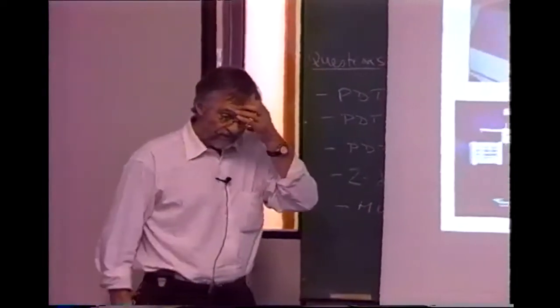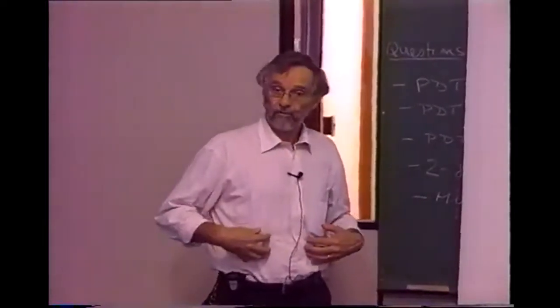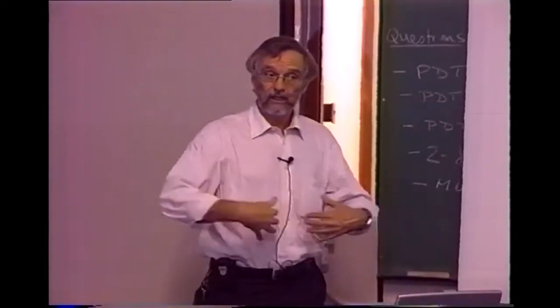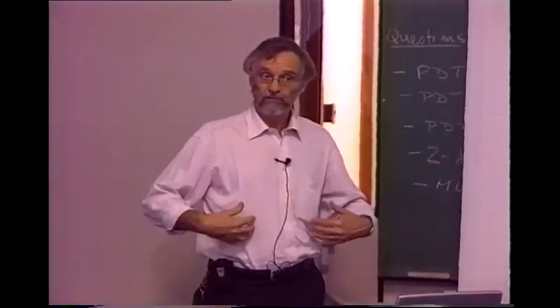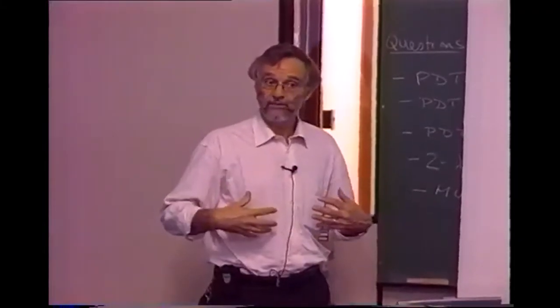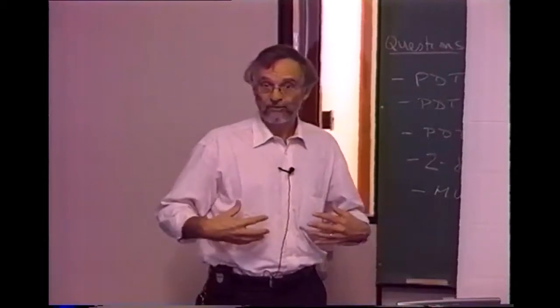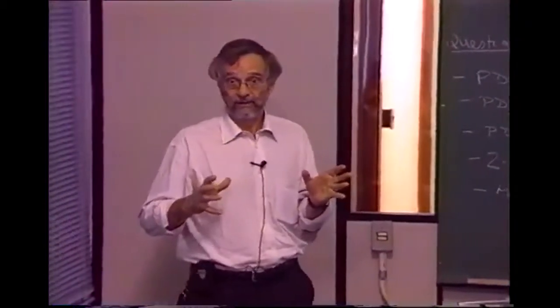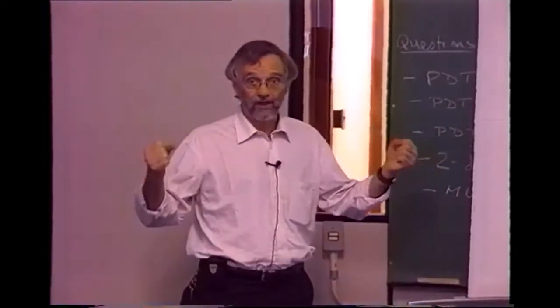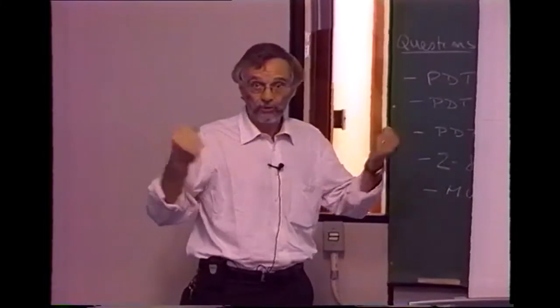People have used lamps, for example, in treatment of ovarian cancer, where you want to irradiate the whole of the abdomen. So basically, at laparoscopy, you open up the abdomen, all the surfaces are covered with cancer, so you want to treat all the surfaces. Now you have hundreds of square centimeters of surface, so you need raw power. And in fact, there's a group in Philadelphia that does this with 2 argon pumped dye lasers blasting away, and it still takes 2 hours to do the treatment.